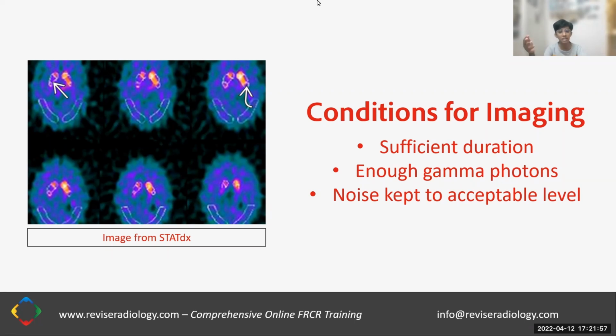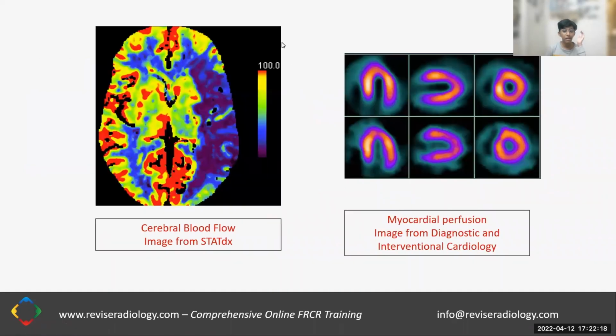So once again, it's a trade-off here between the fact that the pharmaceutical won't stay in the same position in the patient's body for a long time, and the fact that you also need to have the examination be long enough to pick up enough photons. So that's one of the trade-offs that we're looking at here in the imaging.